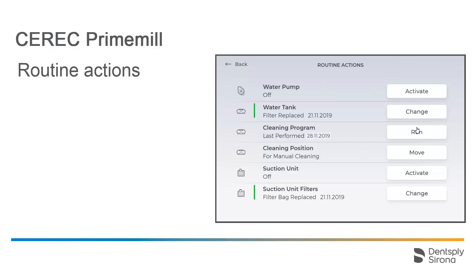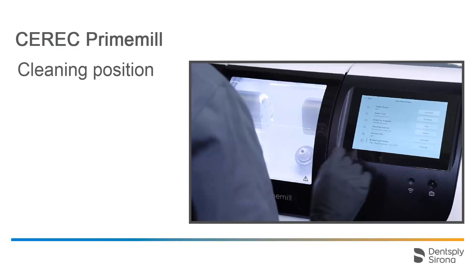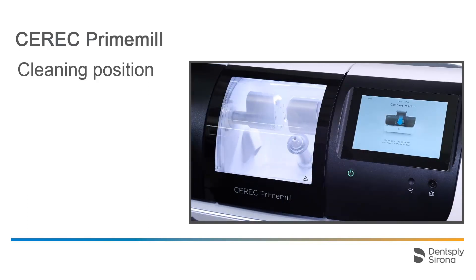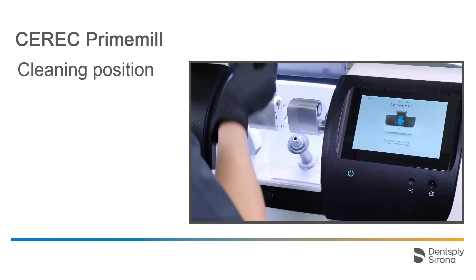Back under Routine Actions, the fourth item offers the option of moving the motors as well as the block axis to a cleaning position. For demonstration purposes, we will watch a short video sequence. The cleaning position is particularly useful for suctioning out the chamber after dry milling of zirconium oxide blocks.